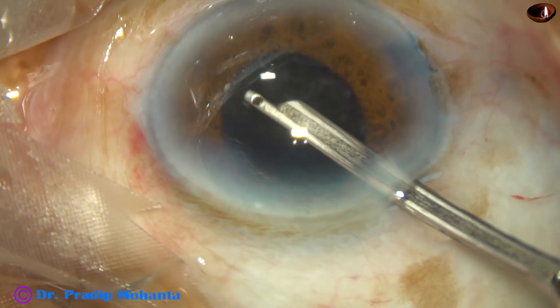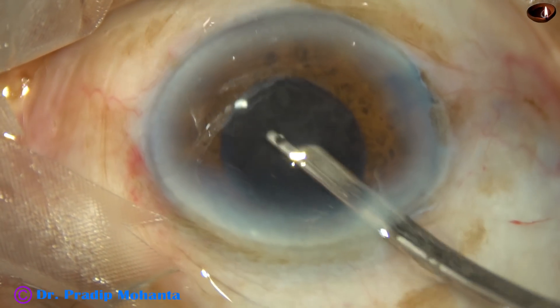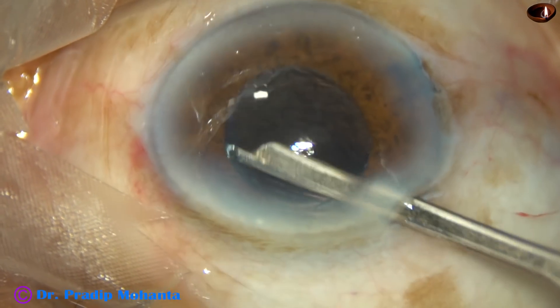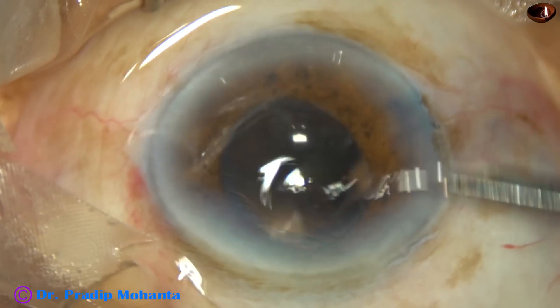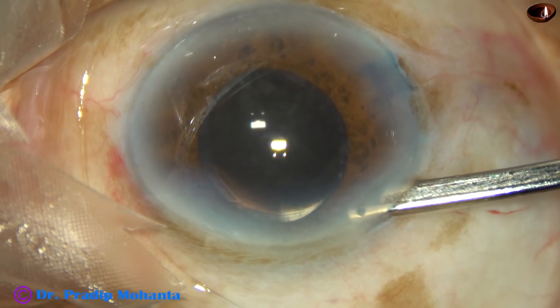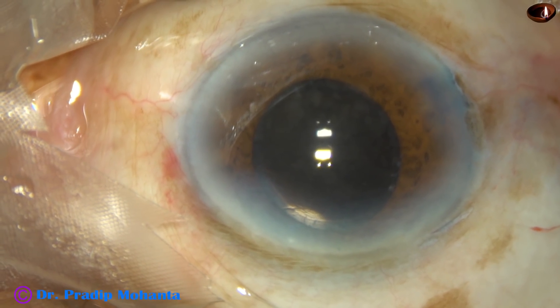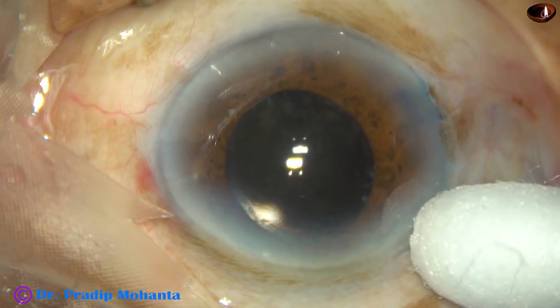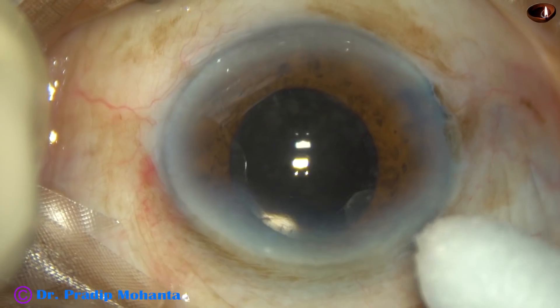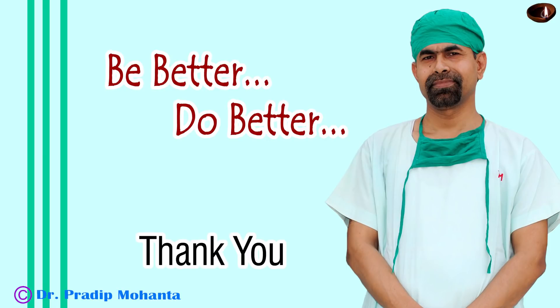After the final lavage, the anterior chamber is nicely formed. I always prefer a Simcoe to form the anterior chamber. The Simcoe is placed at the wound, just give a forward push and come out without depressing the posterior lip, and thus I get a very good anterior chamber. Now all the wounds are checked — there should not be any leakage from any side. You can see the main wound — there is no wound gape.